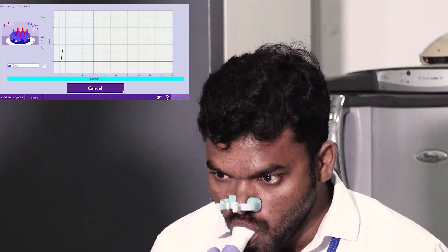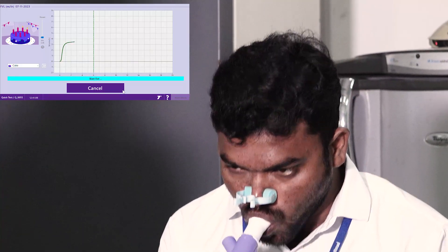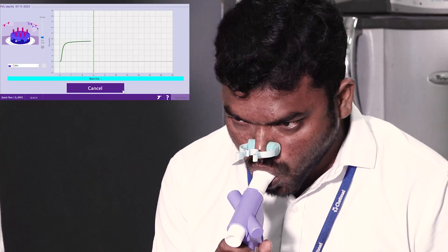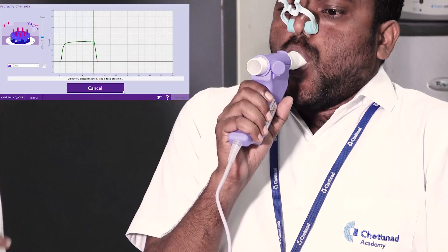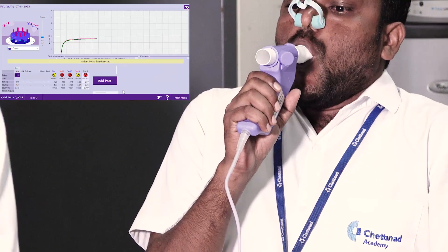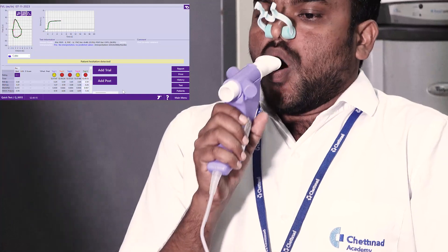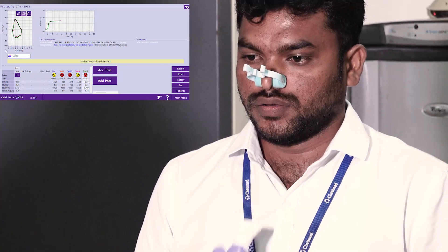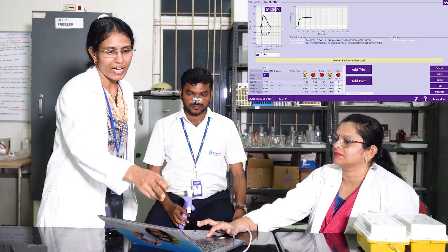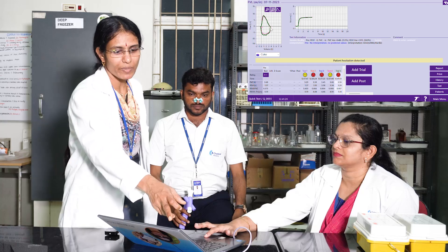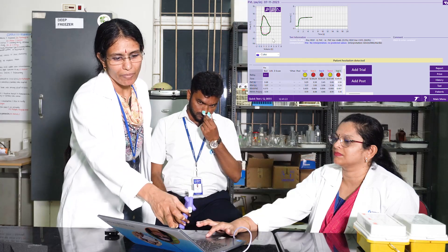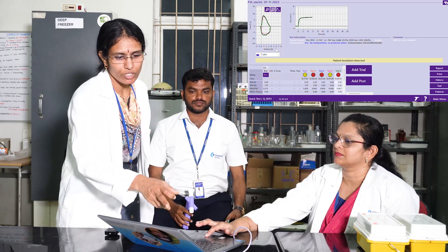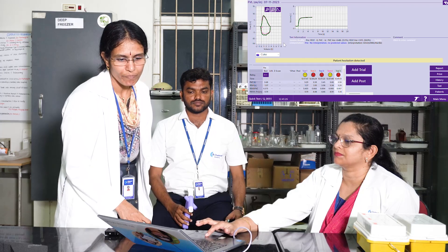It has to be quick. Do the inspiration. This is the flow volume loop which has been obtained, as you can see in the graph. By convention, expiration is on the upper axis and inspiration is the downward graph.